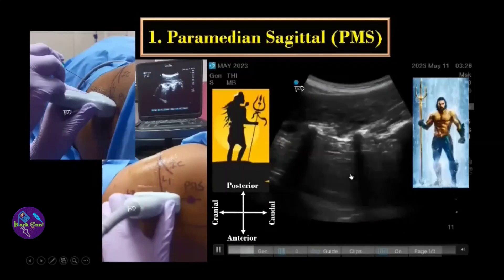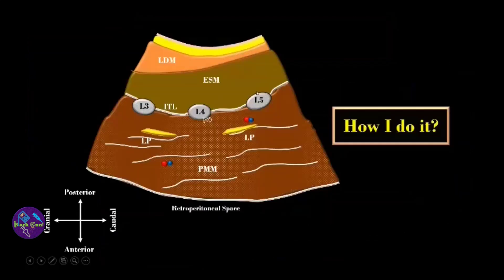Once you get the trident view, the next step is to insert your needle through the acoustic window, stimulate the lumbar plexus, and once you get the desired response, deposit the drug.